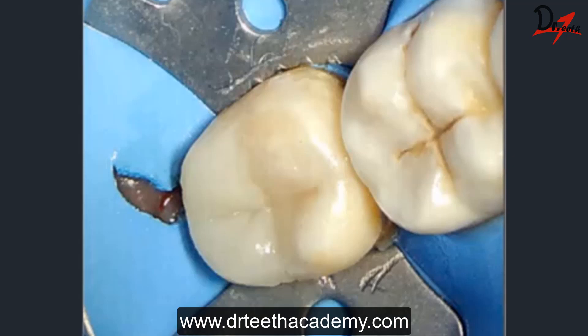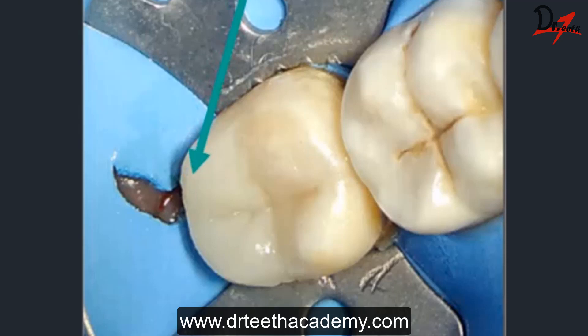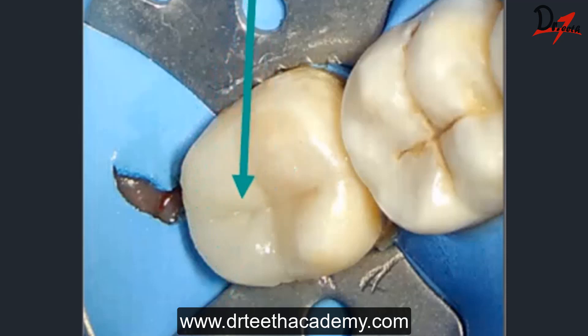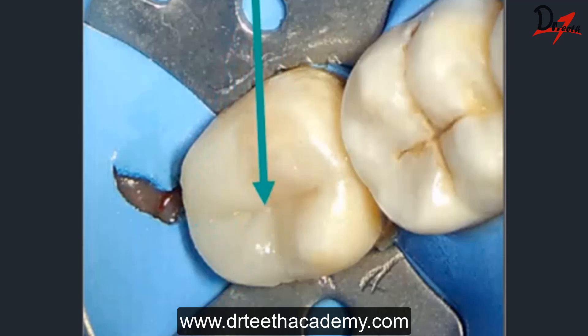Once the bonding agent was done, I sequentially built the restoration. I started with the proximal box using the centripetal technique — starting from the periphery and moving inward. First we create the marginal ridge along the matrix, then step by step we incrementally build up the whole restoration.